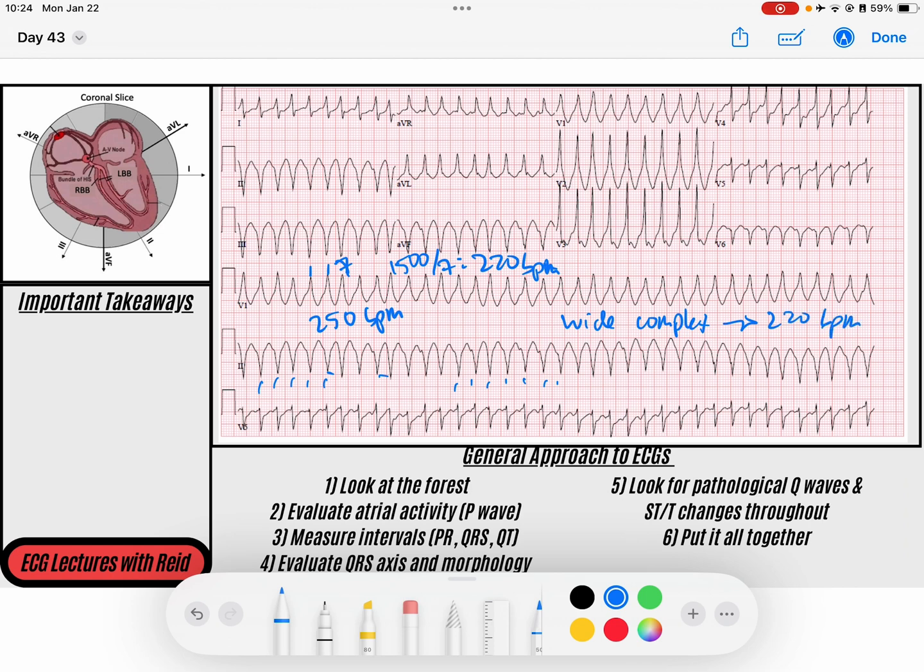We have a wide complex tachycardia at 220 beats per minute. So what's on the differential on this type of tachycardia? We've got ventricular tachycardia. We've got SVT with aberrancy. So let's try to figure out what is this. And so what we want to do is we want to exclude, is this ventricular tachycardia?